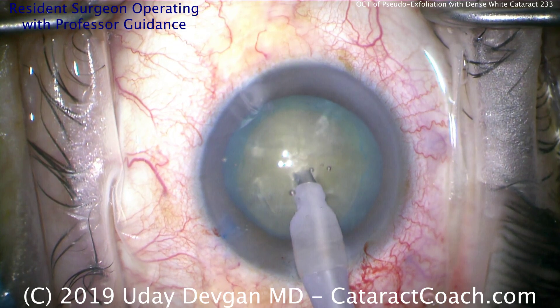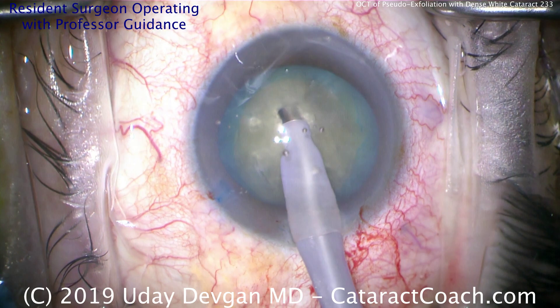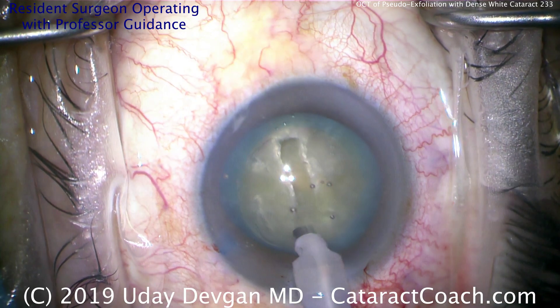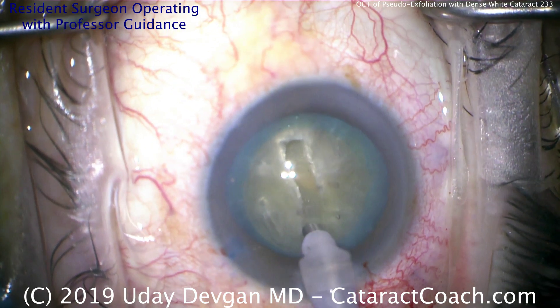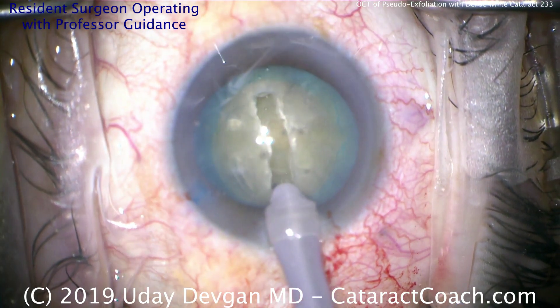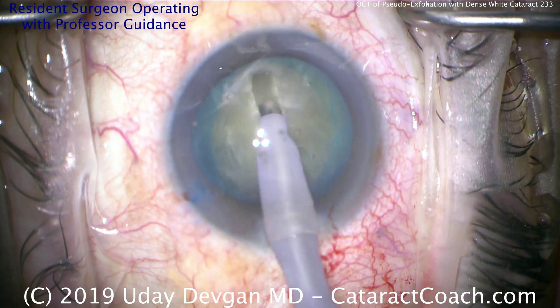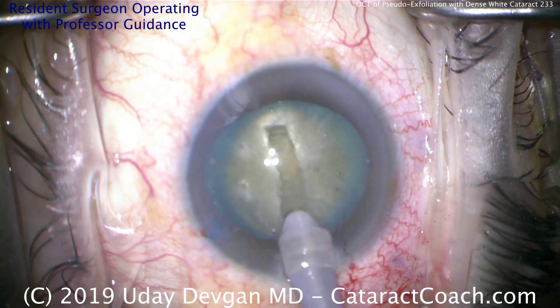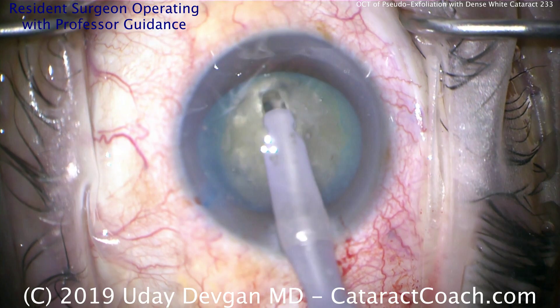Here's the phaco probe — going to make a central groove down the middle of the nucleus. You can certainly do a quick chop as well, but the advantage of the stop and chop method, if you're early in the learning curve like this resident, is that this central trench actually debulks the central dense endonucleus. Instead of chopping it into two halves each at 50% of the lens volume, if you make this central groove, that groove may take up 15 to 20% of the volume. Therefore each half is actually going to be about 40% of the lens volume, making it a little bit easier to deal with.